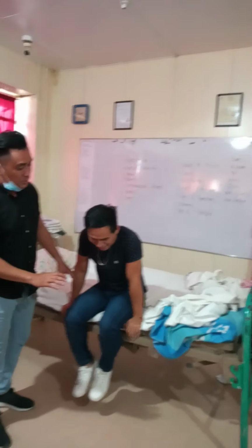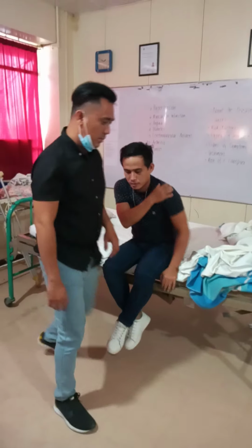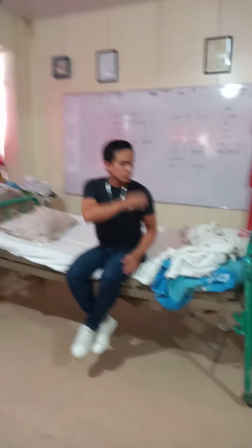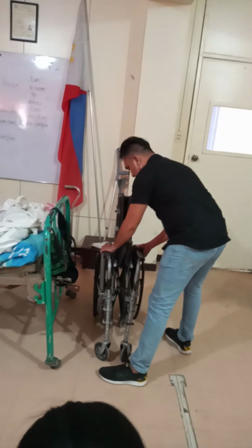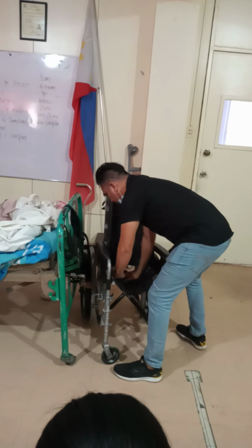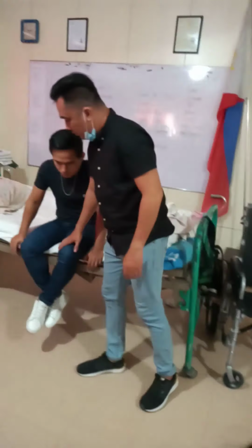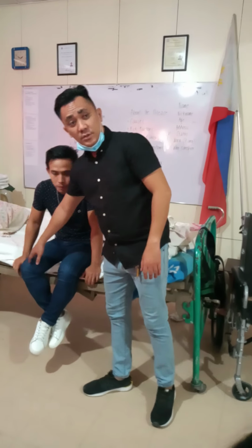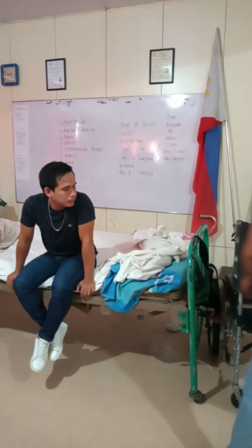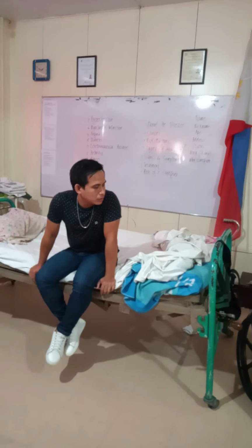Okay. Alright, next one is naka-sitting position na si patient. Then next is the wheelchair. Prepare na to si wheelchair. Now, for the wheelchair should be at the side of the unaffected area ni patient. Okay? Or kung asa man gani ang good side ni patient. So you as a caregiver, you have to identify kung asa iyang good side ug asa iyang bad side. Gets ninyo? So try to ask your patient, sir, asa yung mga good side? Left side, sir. Left side, okay. So the wheelchair should be at the left side of your patient, sir.